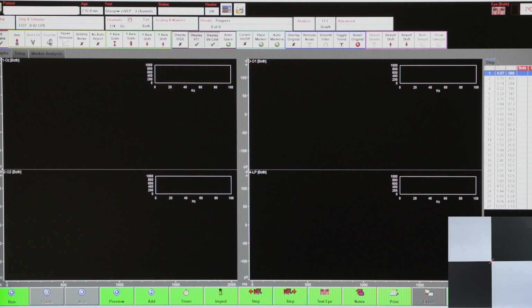Now let's have a look at a couple of examples where we can watch the operator screen in detail. And we're also showing the stimulus screen in the lower right corner, so you can see how the real-time analysis governs the stimulus check size. Now let's orientate ourselves here. We have 4 VEP channels, OZ, O1 and O2, each referenced to FZ, and in the bottom right, our Laplacian channel. On the right-hand side of the screen, we have our list of available check sizes, from very big checks up here at the top, to very small checks at the bottom.